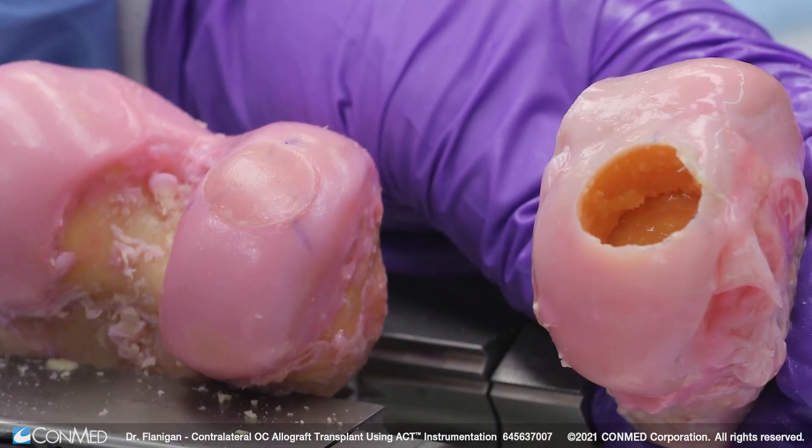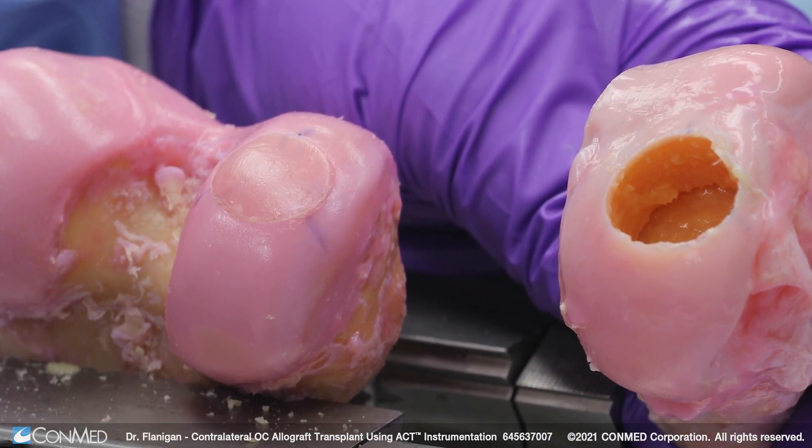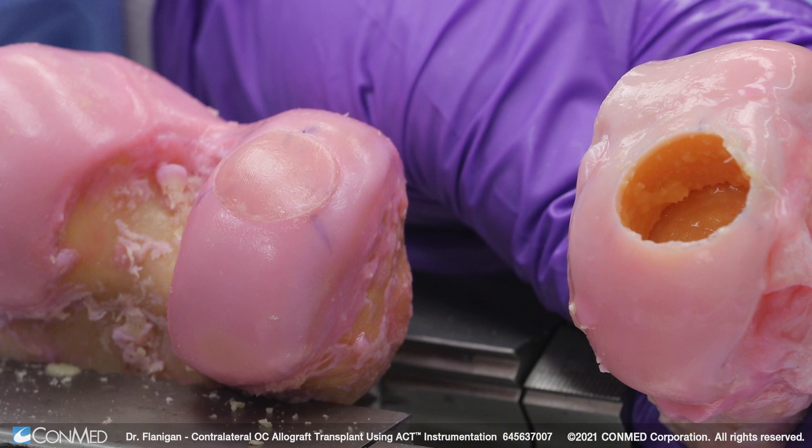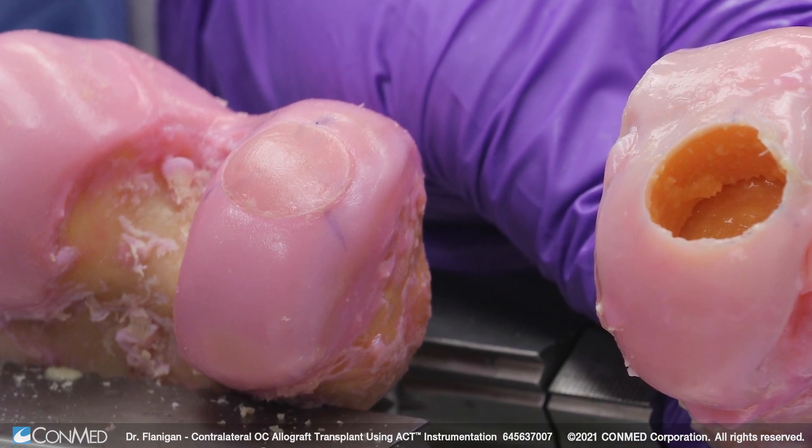Here you can see the finished surgery showing a contralateral and an ipsilateral graft from the lateral femoral condyle to treat a medial femoral condyle lesion. This technique provides a great option to treat medial femoral condyle lesions with lateral allografts. The surgery is easy, reproducible, and will help provide more matches for your patients.